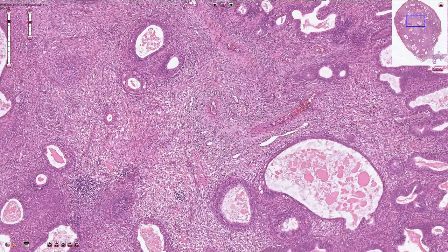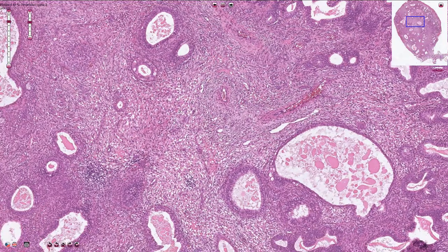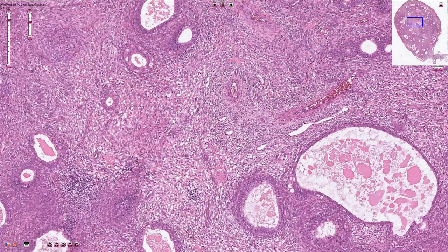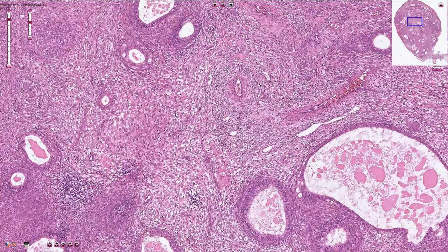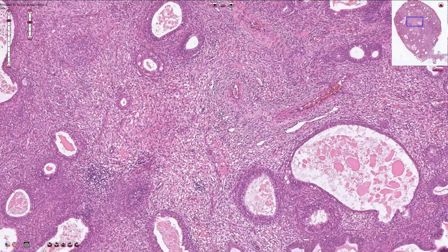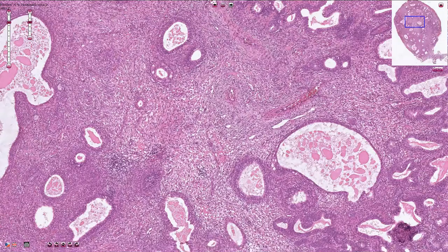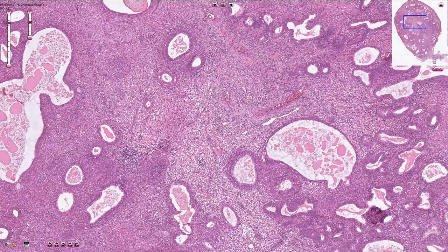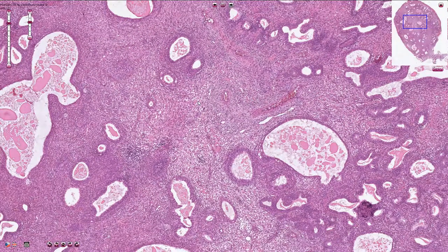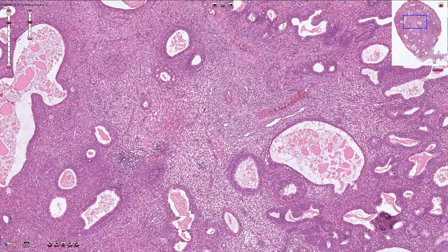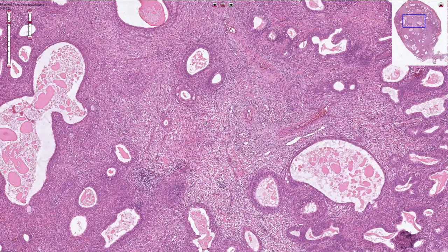Normal endometrial stroma is basophilic. Here we see more spindle-shaped cells with more voluminous, slightly lighter cytoplasm, and therefore the stroma looks like light pink or fibrous material.